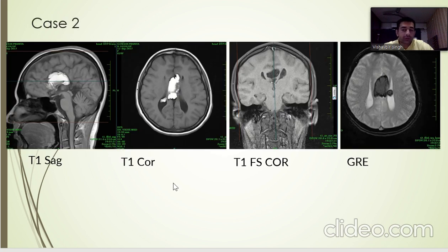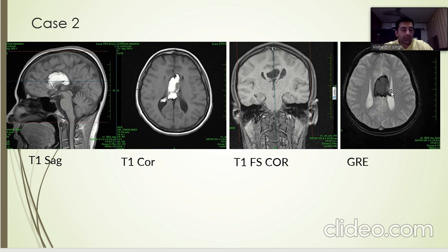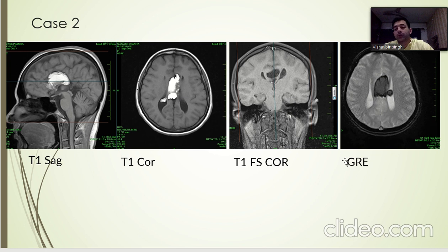In Case 2, we see another lesion in the interhemispheric fissure with extension into the right ventricle as seen on T1 coronal images. The corpus callosum is not well visualized and on fat-sat imaging it shows hypointensity. There is blooming seen on GRE sequence which can be due to peripheral calcification. This is a pericallosal interhemispheric fat-containing lipoma, possibly a dermoid with calcification, with associated partial agenesis of the corpus callosum and intraventricular lipoma or fat droplets due to rupture of dermoid.